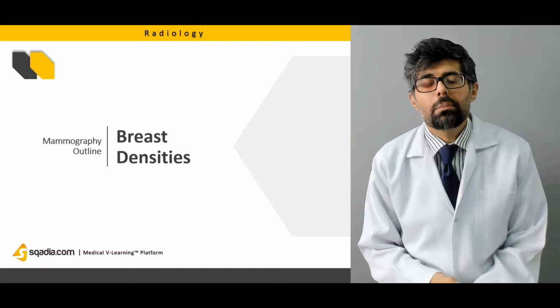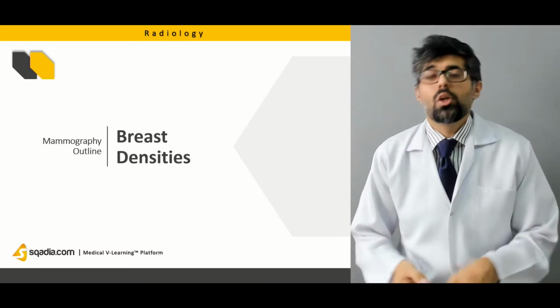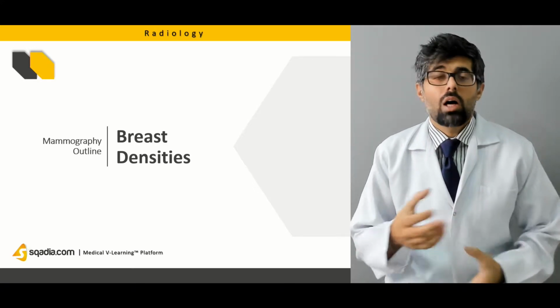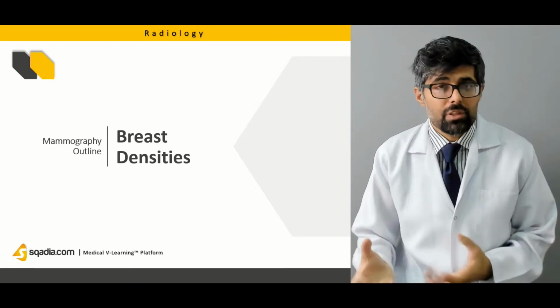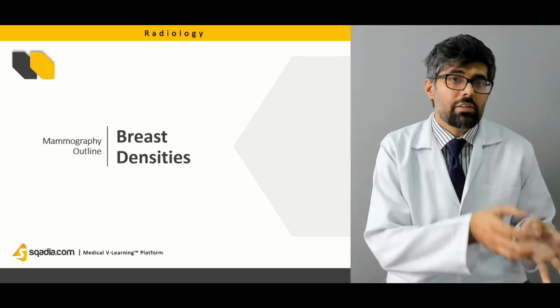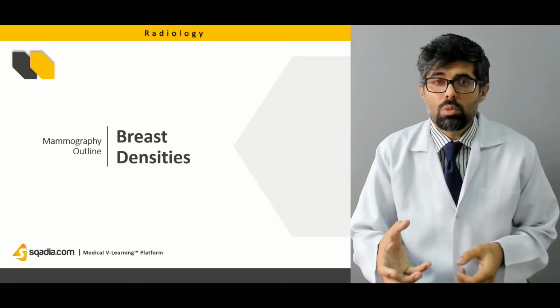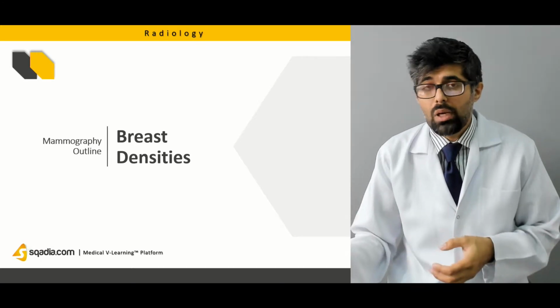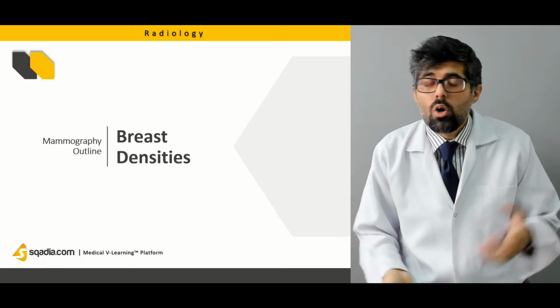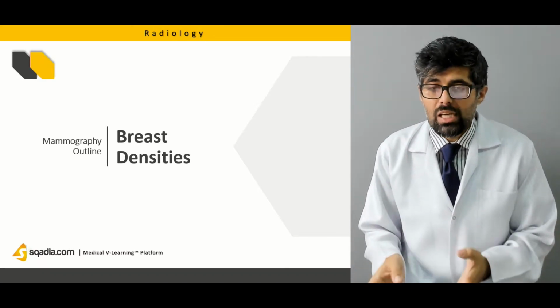Next, we'll study about the breast densities. Now, what constitutes a normal breast density, what are its types, how it can be different in different patients, and how it can be different when it starts to show characteristics of a tumor. Now that tumor can be either benign or malignant, but what constitutes a benign tumor or a malignant tumor? We'll learn all about it in this lecture.